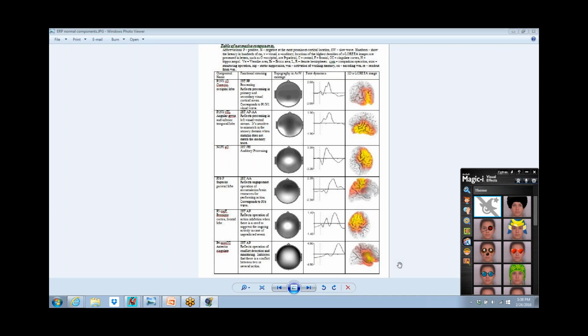For instance, frontal midline theta. It's theta at the frontal midline. Spectrally, on an instantaneous basis, it would look very similar to excess theta that was frontal, which isn't the same thing. Frontal midline theta is healthy, normal memory function. It's a brief burst, less than a second long, at the frontal midline on a memory task.